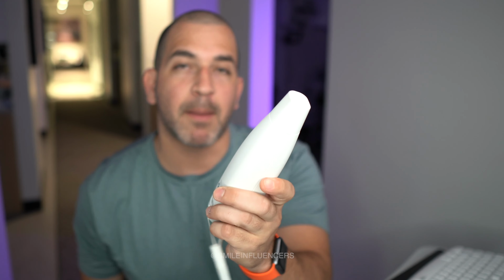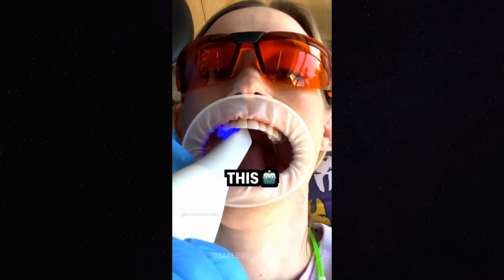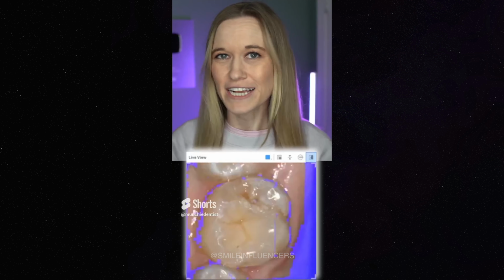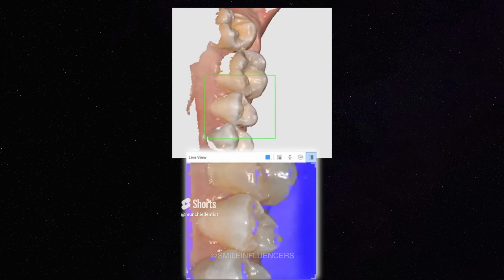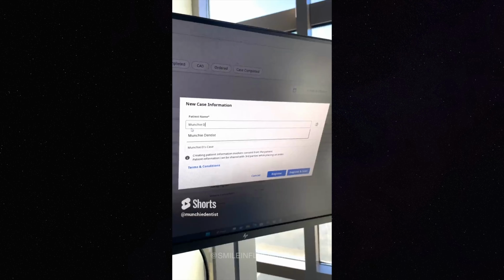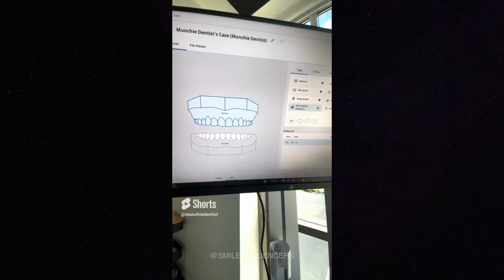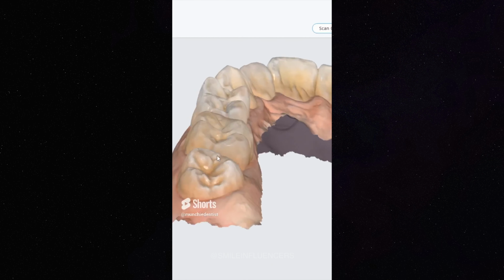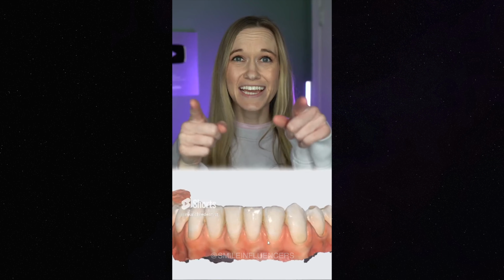So the amazing thing about being able to scan someone's teeth digitally that goes to a computer is that you can get very accurate impressions if you do it the right way. You can send the case electronically, which means that the case is sent faster towards the laboratory of your choice, and it doesn't get distorted. But what's also amazing about the digital scanners is that when you scan your teeth, you can do a lot of cool things like restorative dentistry, orthodontics, aligner cases, really predictably.